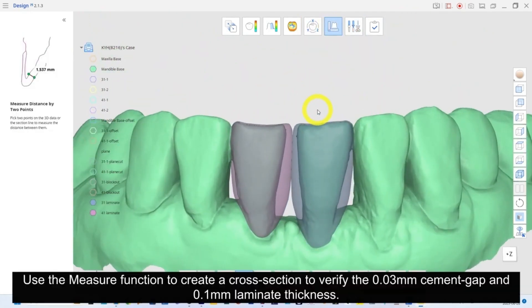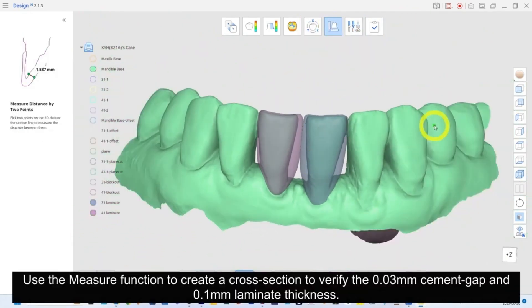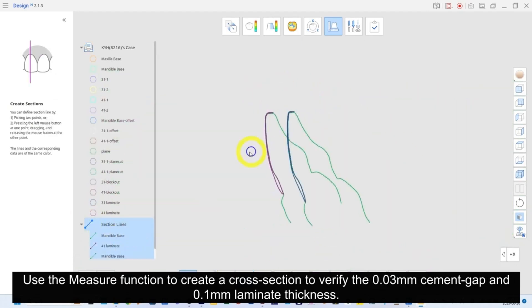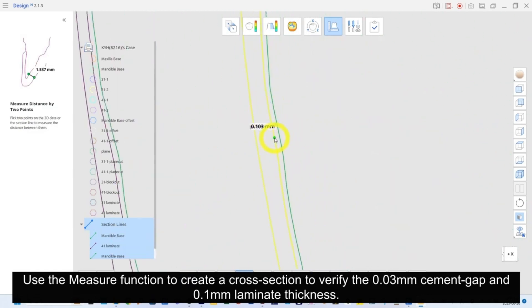Use the measure function to create a cross section to verify the 0.03mm cement gap and 0.1mm laminate thickness.